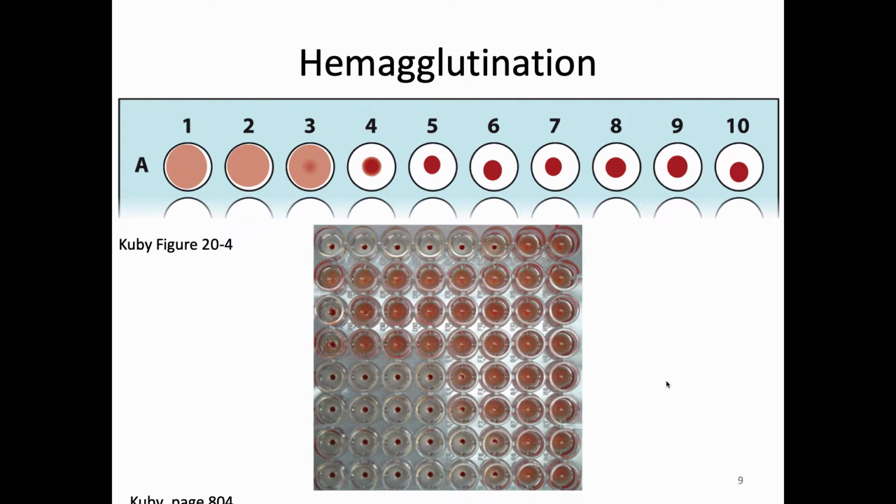Officially, this is one of those. This isn't a blood typing example, but it gives you the idea. In some situations, all of the antigens and antibodies cluster in a little group right at the bottom of the well. And in other cases, they don't. They're sort of spread out and not making that nice clump. And so we can actually examine the differences in antigen-antibody binding.